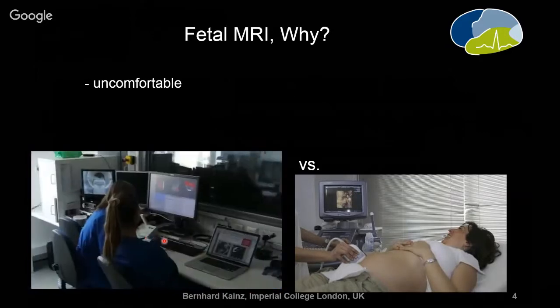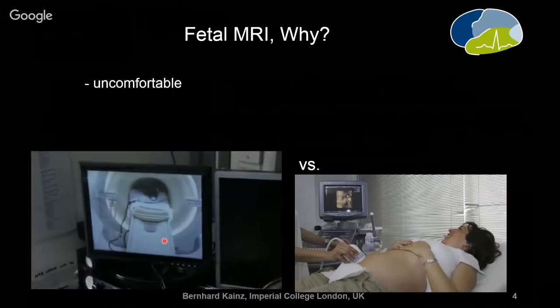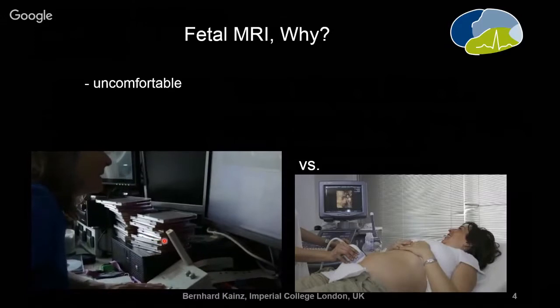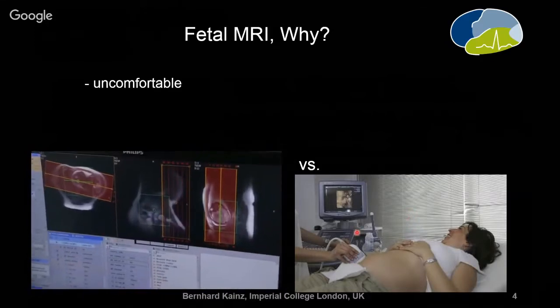And the scan itself takes an hour. Lying in there for an hour is quite exhausting for pregnant women. An ultrasound scan would usually take maybe 20 minutes, like here on this side.